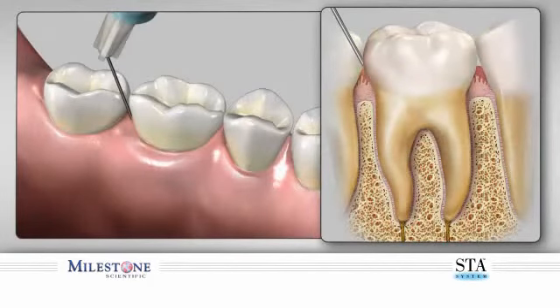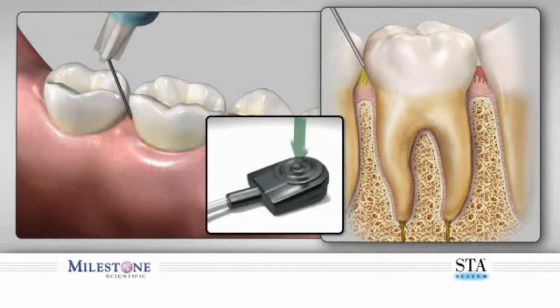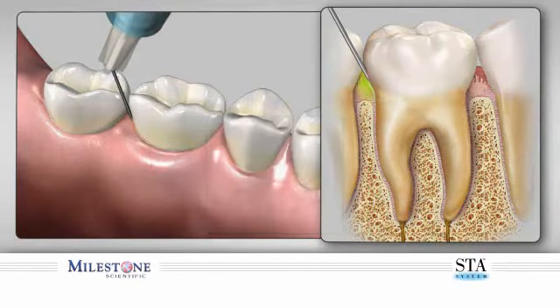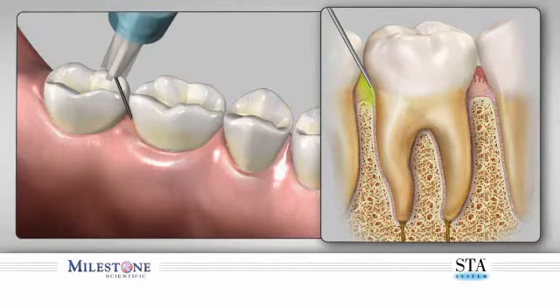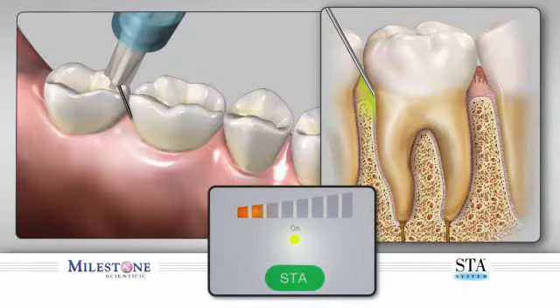While holding the handpiece with a pen-like grasp, approach the tooth at about 45 degrees with the bevel towards the tooth. Place the needle very slowly into the gingival sulcus as if it was a periodontal probe, while simultaneously initiating the control flow rate. The control flow rate is initiated by depressing the foot control, and after 3 audible beeps, you will hear the unit announce "cruise." Once you hear the word cruise spoken, you may remove your foot and the STA system will continue the flow of anesthetic solution until you depress and release the foot control again to stop the flow.